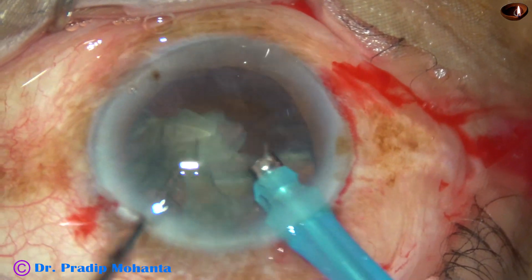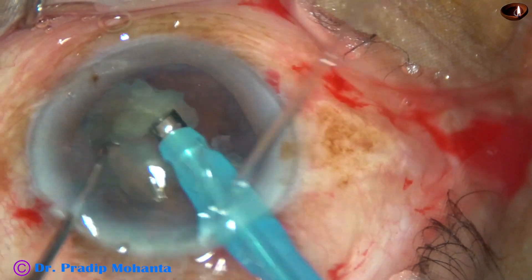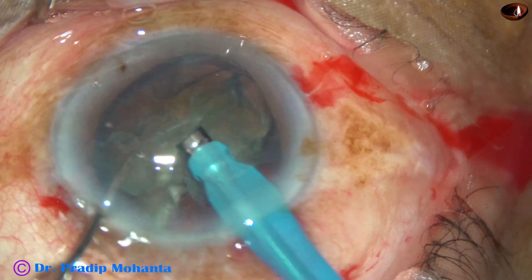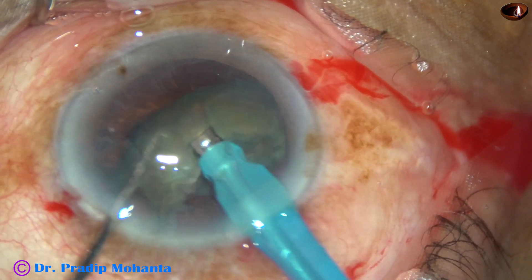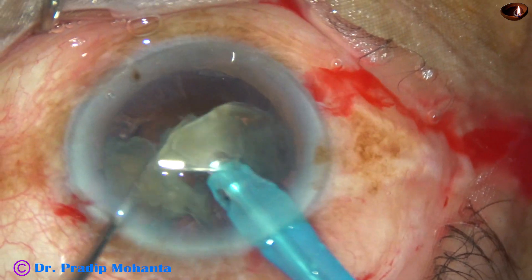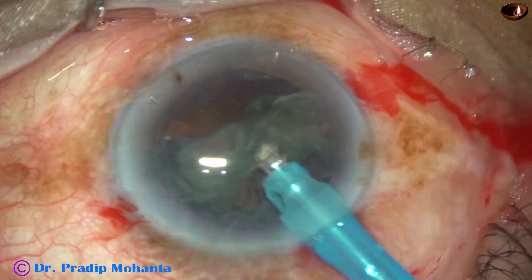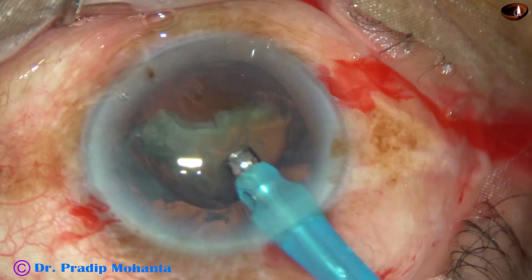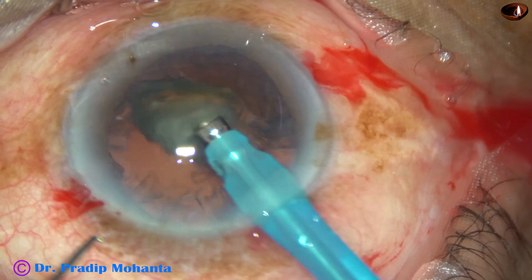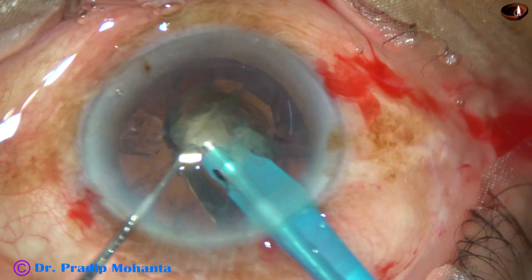After chopping the nucleus into several fragments, each fragment is emulsified using ultrasonic energy. In grade 3, grade 3 plus or grade 2 plus nuclear sclerosis, you can use 50 to 60% ultrasonic energy. In this case, I used 60% ultrasonic energy, 45 ml per minute flow rate, and 450 mmHg of mercury vacuum.